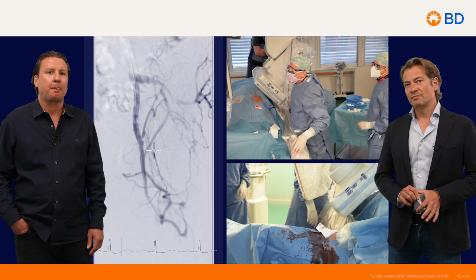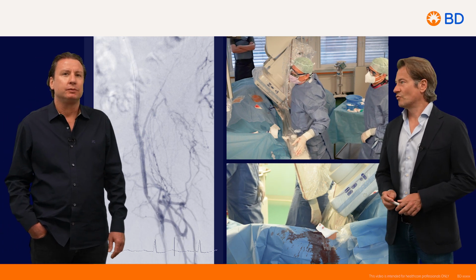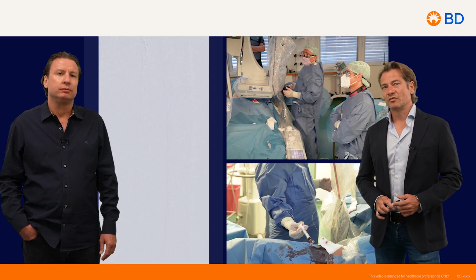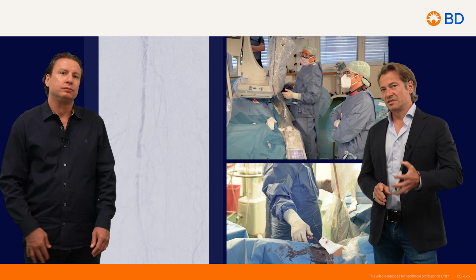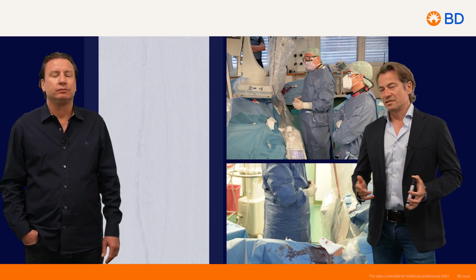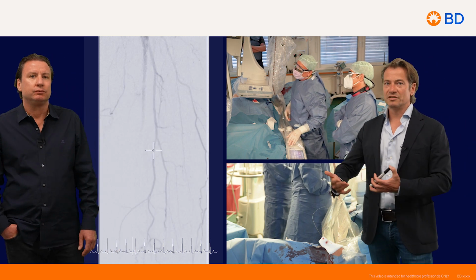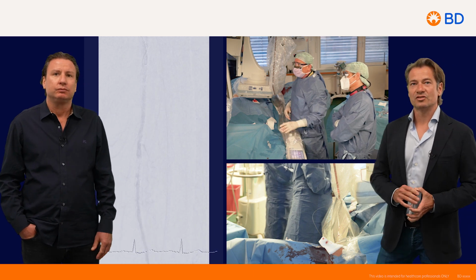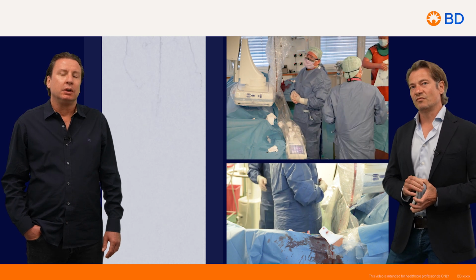By the way, there are some options to treat this. One option would be just to go for ballooning, especially given that it's a long way coming from the arm. But here we decided for another treatment, especially for this lesion in the mid portion of the SFA. For these interventions coming from the arm, you need long shaft devices, and you should plan the treatment a little bit with the material which you have in stock. That's why you should plan after this angiogram what's the best treatment.